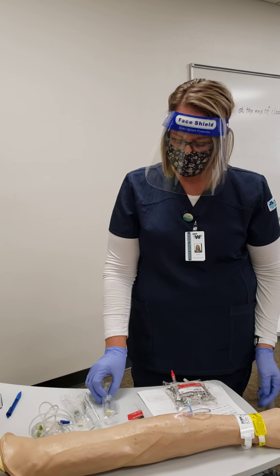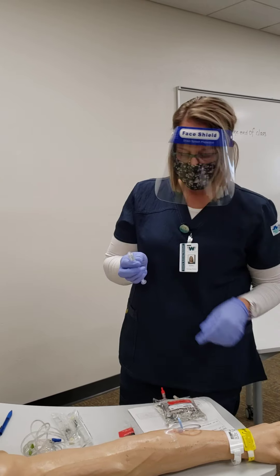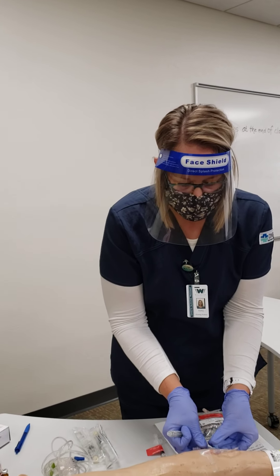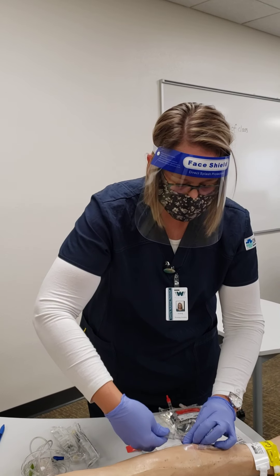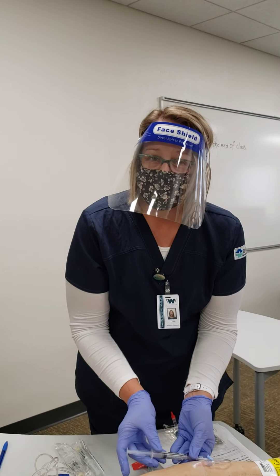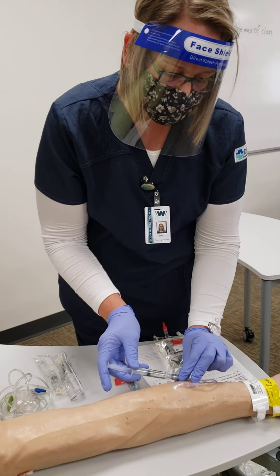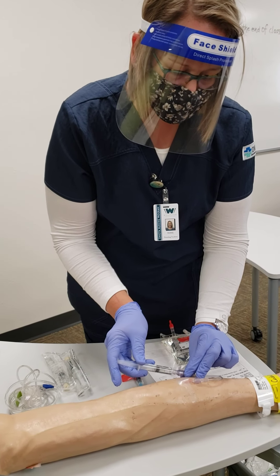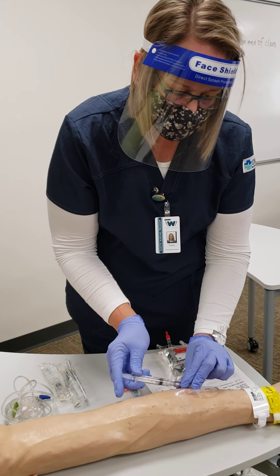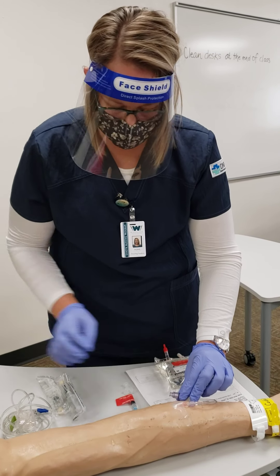Shirley, we're going to go ahead and do your morphine sulfate, okay? We're going to open up the saline flush and do that first. We pull back just a hair to make sure there's no air in there, connect it, and pull back just a hair to get a little bit of blood return to make sure there's no infiltration and that the IV is patent. We go ahead and flush the saline nice and slow to make sure everything goes through. Shirley, let me know if you're having any trouble. Just a little burning? That's absolutely fine and totally normal. And that's done.